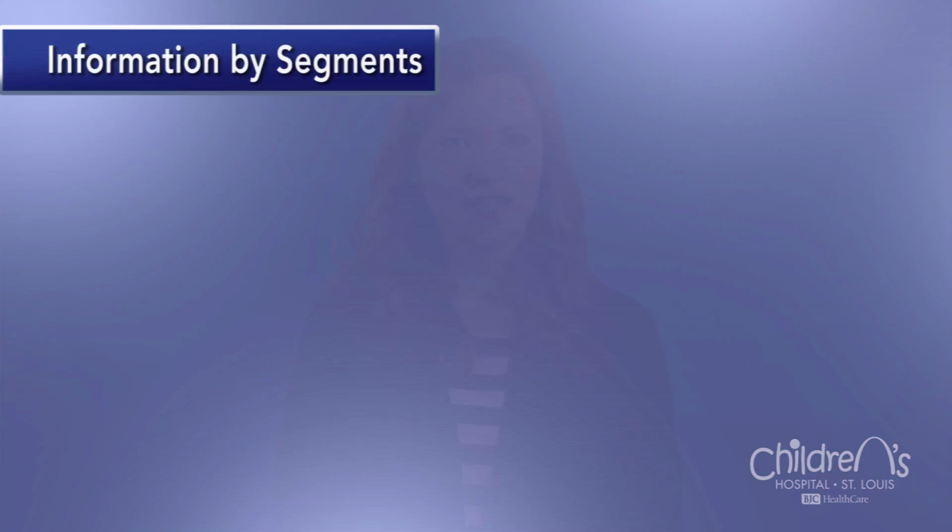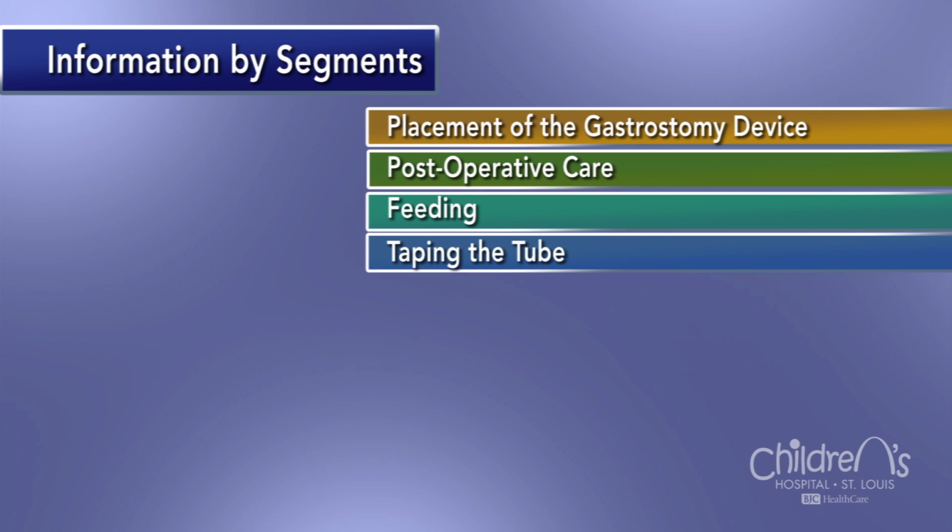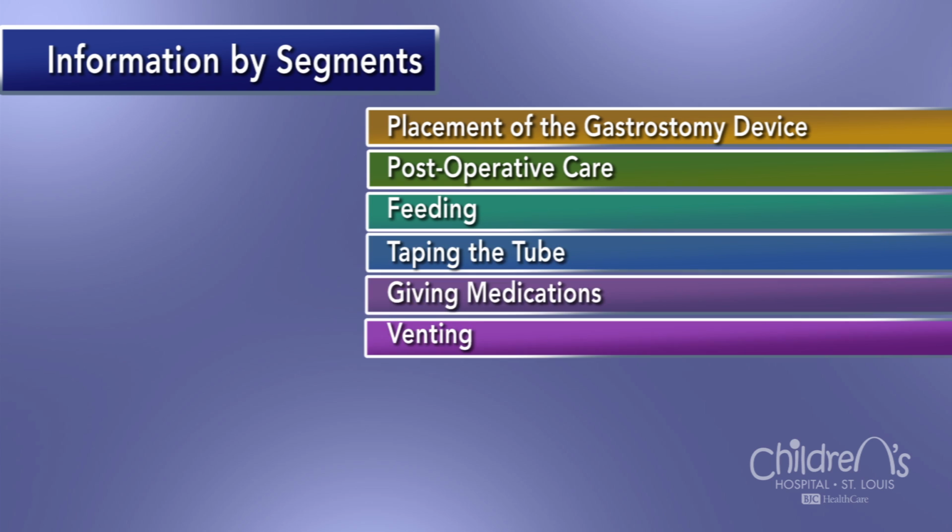Welcome to our program. In this program, we'll demonstrate how to deliver nutrients and medications through the tube and how to apply a dressing to the site. You may choose to watch all segments in order or focus first on the specific topics you feel are priorities.